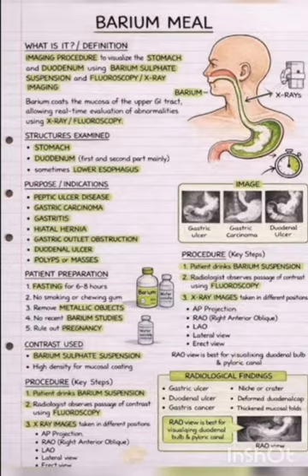After that, rotate the patient clockwise to make a coating of barium on the stomach mucosa. Afterward, the patient is placed in prone position. In this position, the barium enters into the duodenum through the pylorus of the stomach. The radiologist observes the flow of barium sulfate in the stomach under the fluoroscopy, and whenever the barium enters into the duodenum, a spot film is taken.